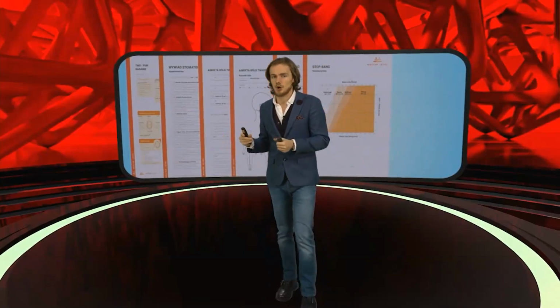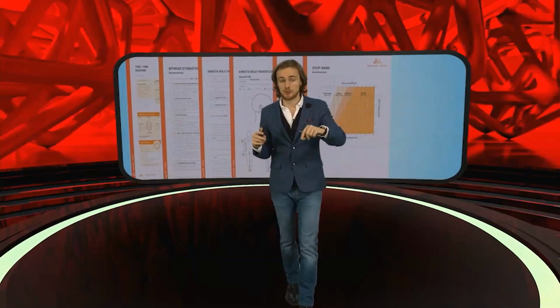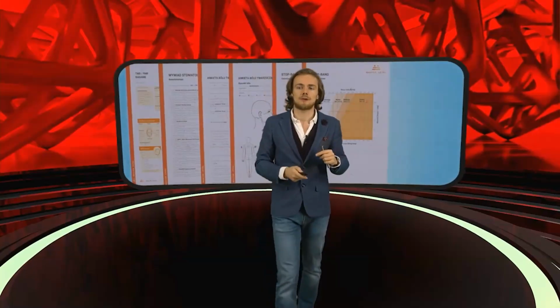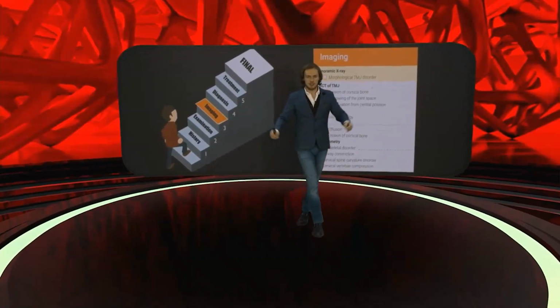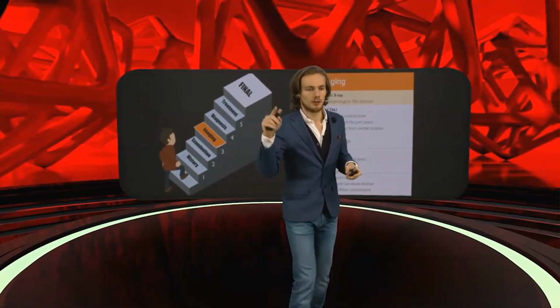But if we know all of that, if we know that the patient has some acute problem in the joint, or we are in doubt whether it's a muscle problem or a joint problem, but we know for sure we have to look inside, then we are going one step further from the examination to the imaging to confirm our diagnosis. It's not like we look at the panoramic X-ray first, then see some bone degeneration, and say, "Oh my God, I will not make veneers for you because I see there is something." You don't really know what it is. You didn't confirm it with the CBCT.